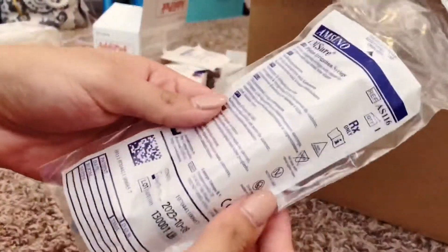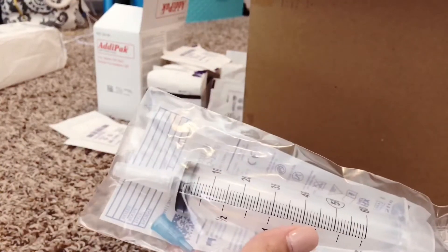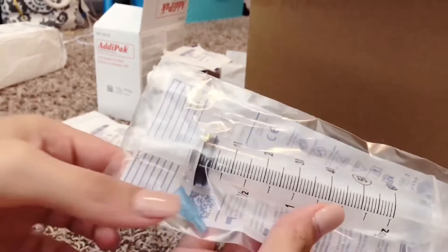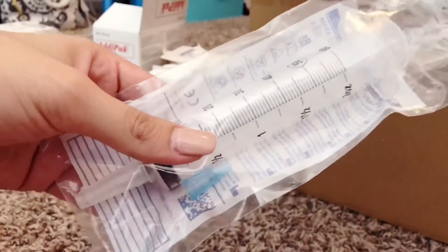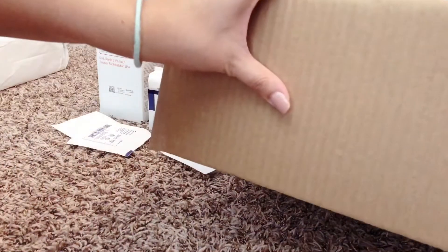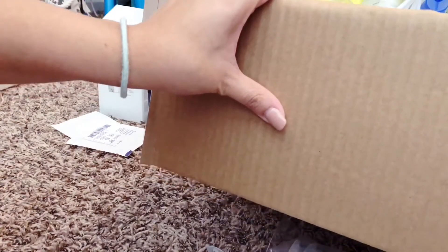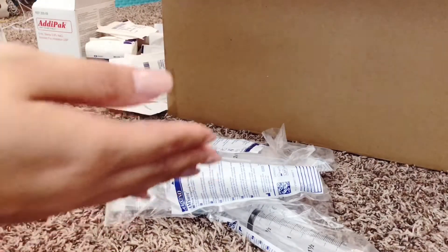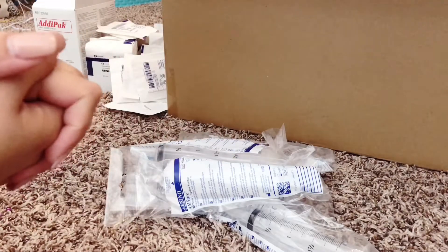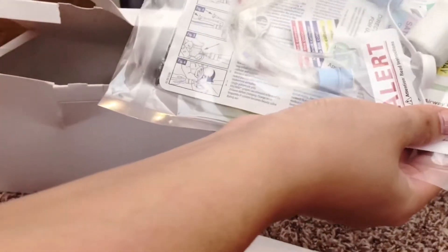These are the syringes we get — we use the 60cc syringes. They come with a little blue adapter for the g-tube ports, and you can actually take the bigger part off and it fits the tip without the blue adapter if you lose it, which we do quite often. We got six of them this month, but we only get 10 syringes a month through our DME company — that's all our insurance covers.